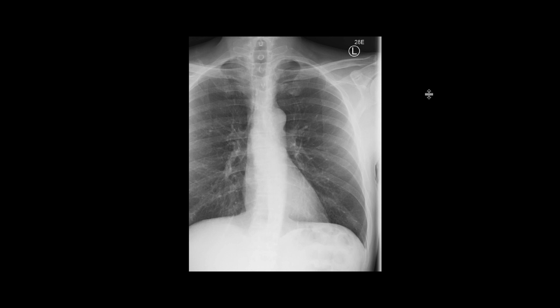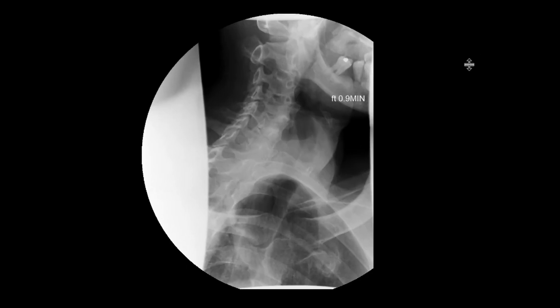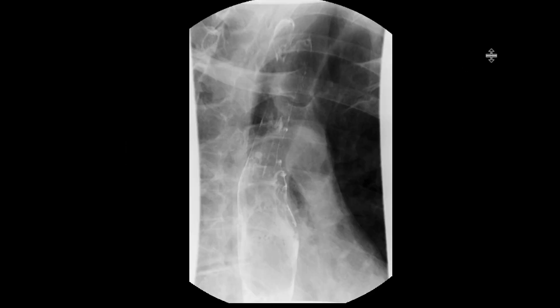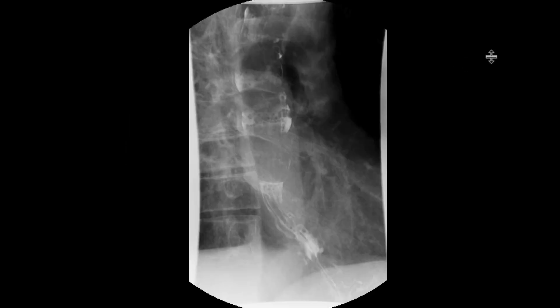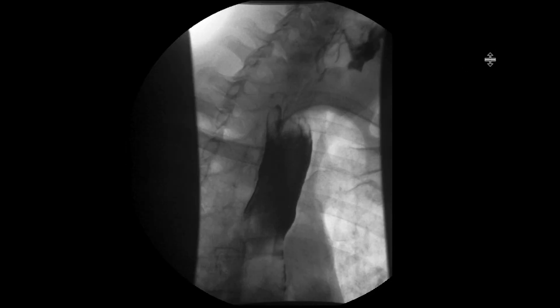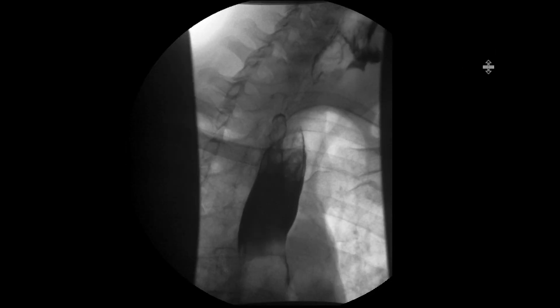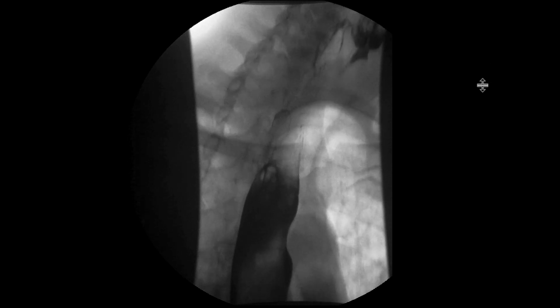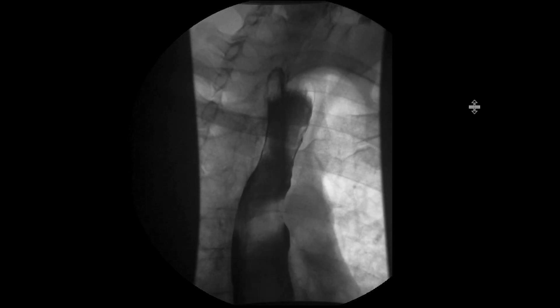This is a patient who presents with dysphagia, and we did an esophagram to further evaluate the etiology. We give contrast and have a few still images of the upper and lower esophagus, then cine clips of the patient swallowing in real time.